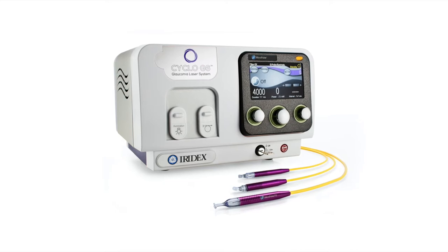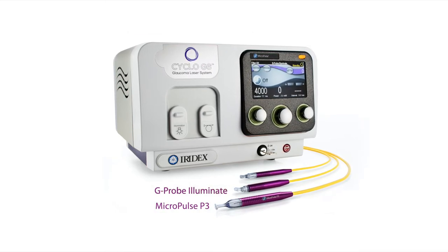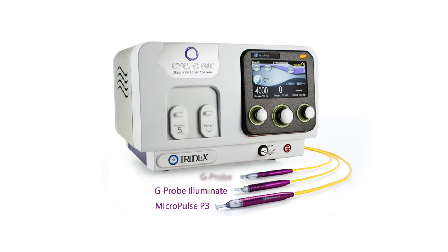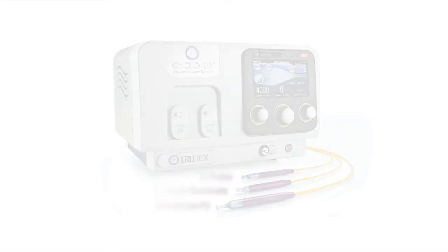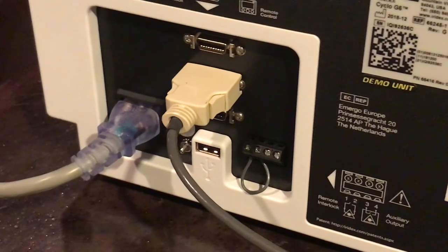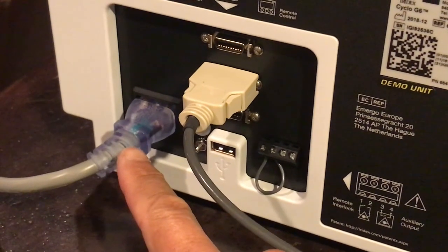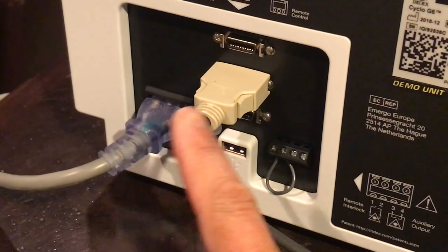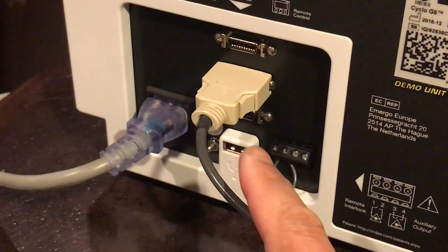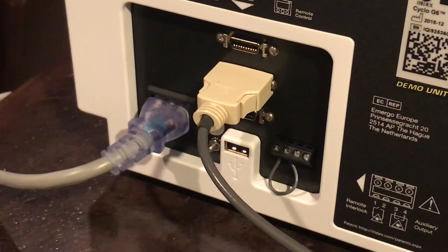The Cyclo G6 consists of the laser box, the foot pedal which initiates the treatment, and a number of delivery devices capable of both continuous wave treatments and micropulse treatments. On the back of the Cyclo G6 you have a power input for the included power cord, and three multi-use ports that the foot pedal can be plugged into.